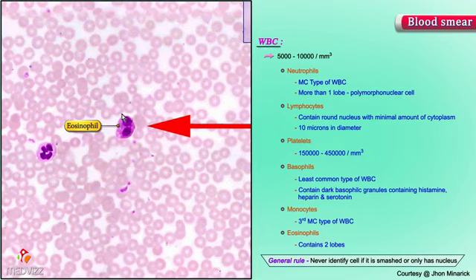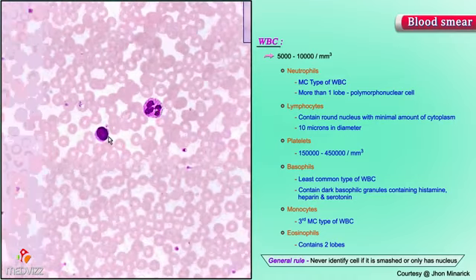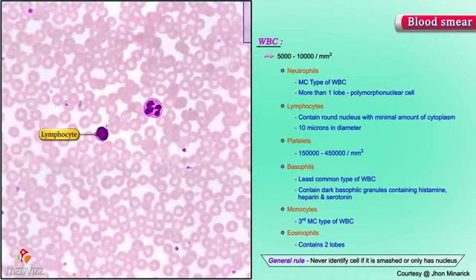So I think we covered it all. We covered the red cells. We covered the platelets. We covered the neutrophils. We covered the eosinophils. We covered the lymphocytes. I think we had a nice macrophage and a basophil as well. And once again, on the basis of the few things we looked at here repeatedly, I don't think there is anything on this slide that you cannot identify if somebody asked you to identify. Thank you very much.